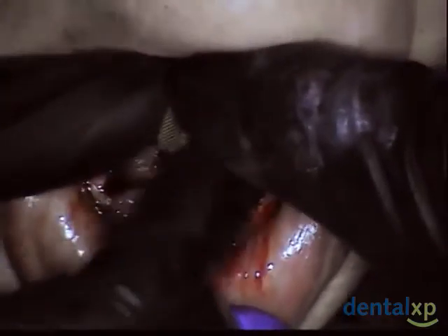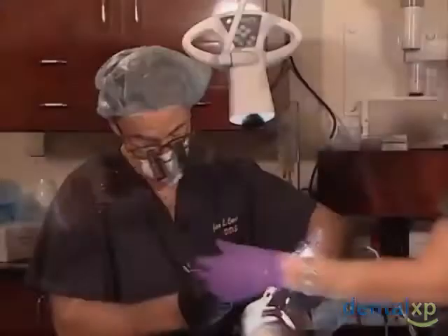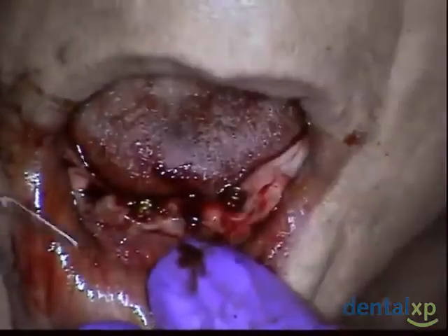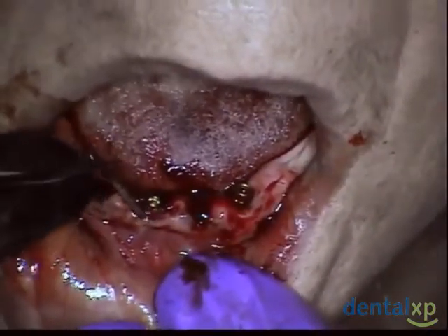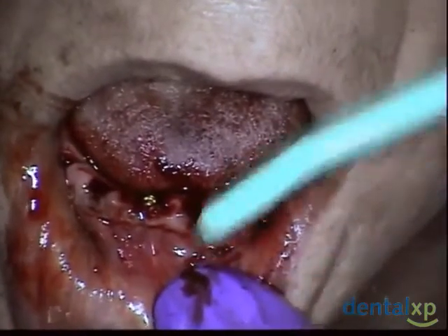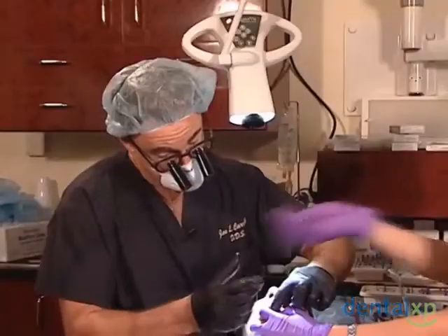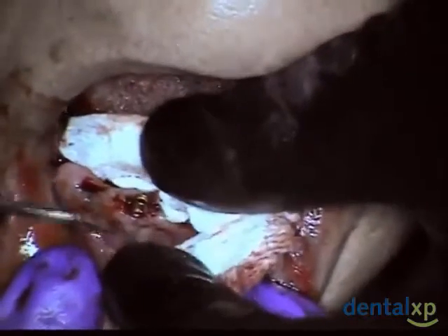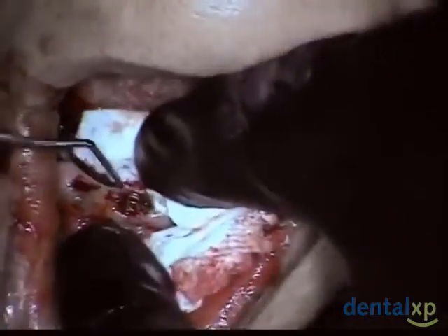Now I'm pretty certain that I won't need to be going back in, so I'm going to place all these with my finger wrench until I can't go anymore. I want to very gently push my tissue back here so that I can make sure that I'm not damaging my attached tissue. You see, we've pushed that attached tissue facially, so we're not trapping it underneath our implant. Remember, we made a little mini incision here so that we're going to make sure that we're in the right position.